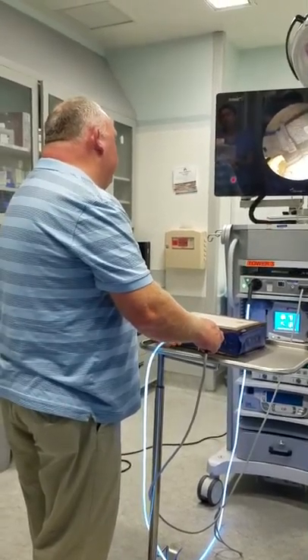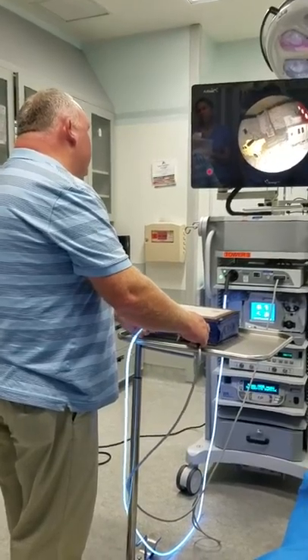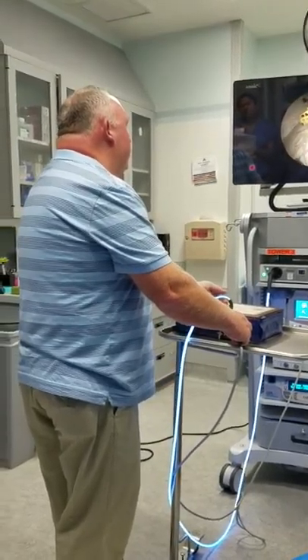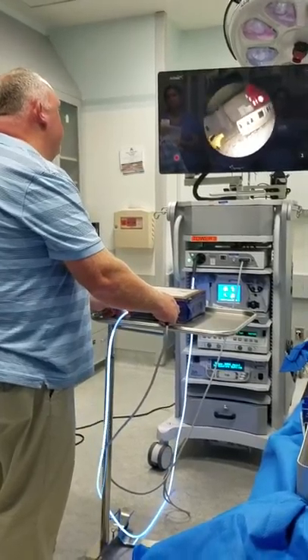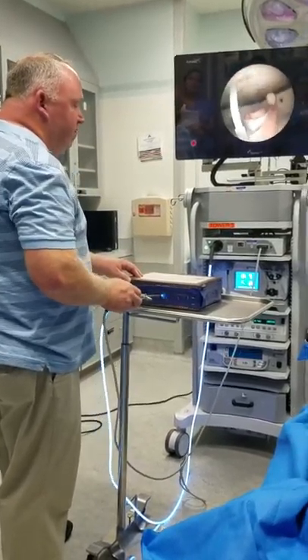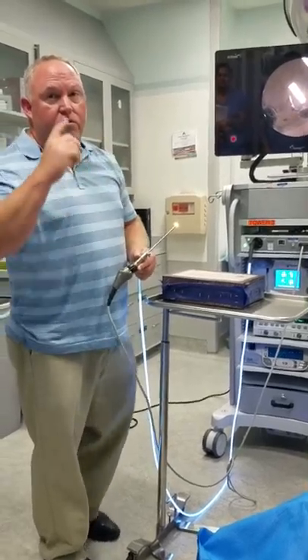Coming here, how do I see around the corner? If you come to the side of it, you get a different angle by pushing this way or that way. I can see what's behind you over here. So I'm asking you guys to do this. I put you in one of the portholes, and I'm asking you to find certain things. I might say find the dice, find the Statue of Liberty, and find different angles, okay?